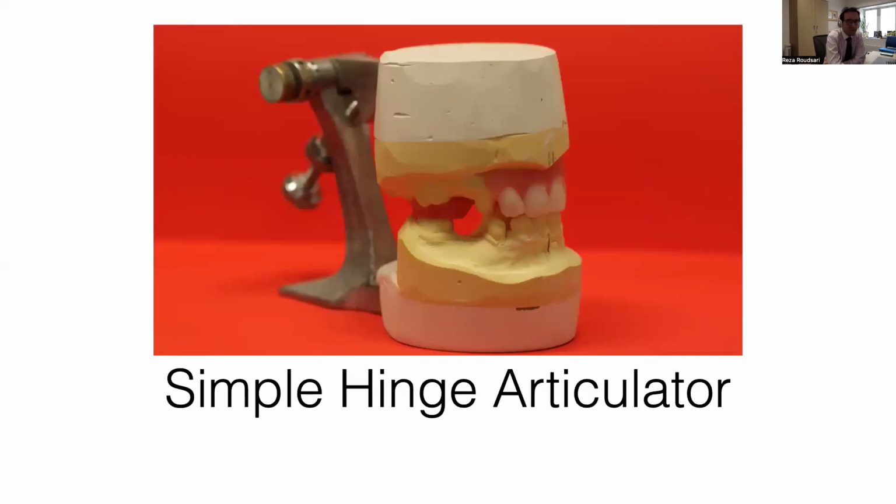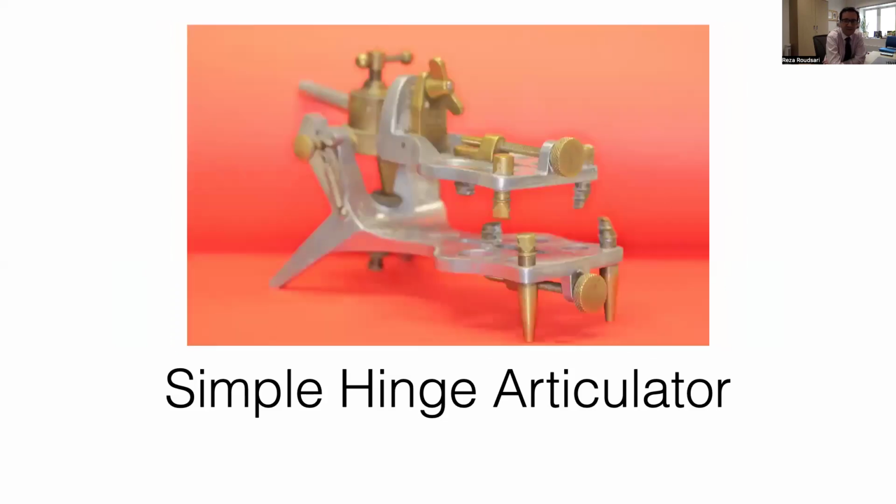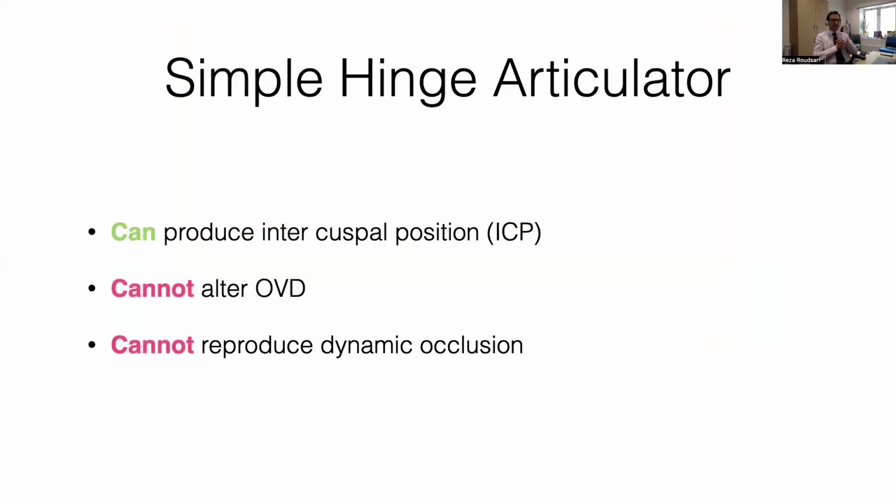And then you go to the simple hinge articulators, and they don't replicate anything, if that makes sense. They're just 2 bits of metal, whereby you put your casts, and they can come in a variety of forms. But what is really important about the simple hinge articulator is that it can only reproduce intercuspal position. You cannot change OVD, you cannot reproduce dynamic occlusion. To be honest, last year we did not have any simple hinge, but then you go to practices, and if you're just doing, for example, a single crown on a premolar, that's probably what they use for you, and just mount it on.